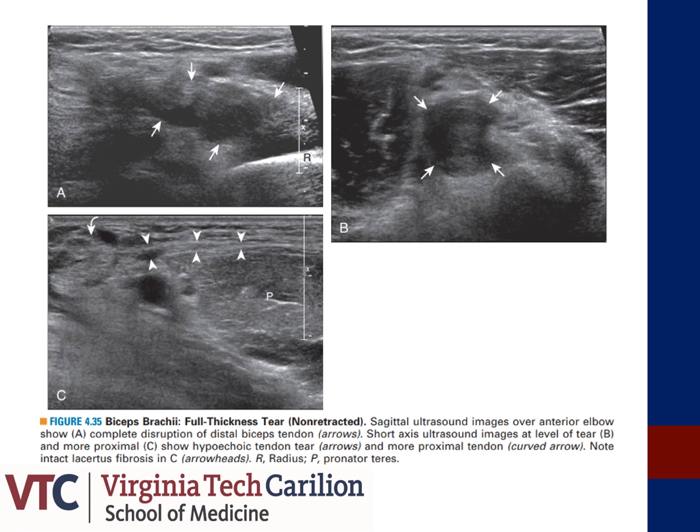Again, this is another biceps tear. However, this one is not retracted like the previously identified. I think that is best represented in figure A, where you can see the stump very near its intended insertion on the radial tuberosity.